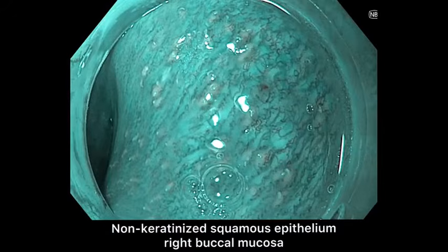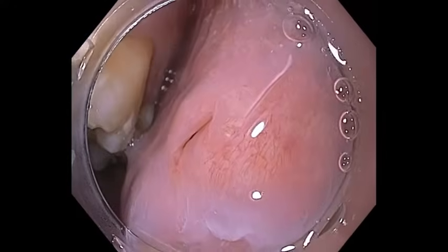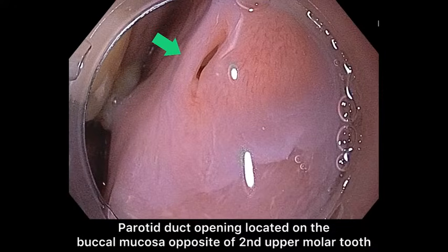This is non-keratinized squamous epithelium of the right buccal mucosa. The parotid duct opening is located on the buccal mucosa opposite the second upper molar tooth.